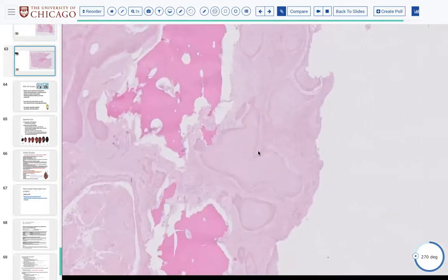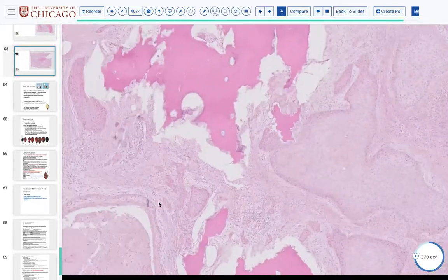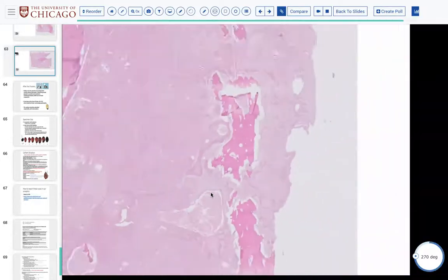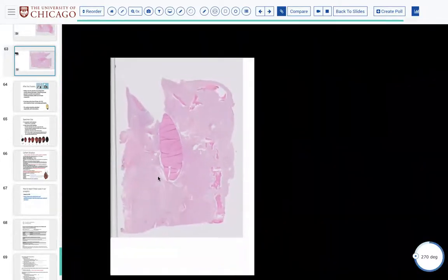This is absolutely horrifically destructive, displacing this person's mandible, highly infiltrative, with perineural invasion. So it's all of these other ancillary features of the tumor that in clinical practice are much more important than well, moderately, or poorly differentiated. Does that make sense?